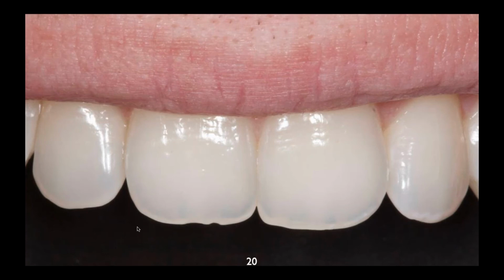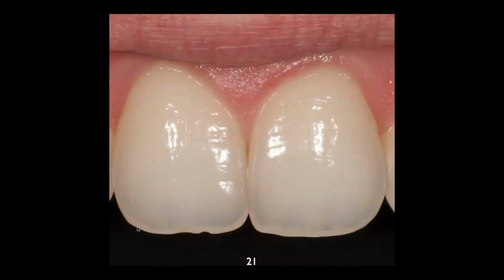The big problem I see with a lot of these zirconia crowns and big zirconia cases that have to have a natural color is that the framework, the zirconia that you put the porcelain on top of, is way too high. And there's no way that light can get through that the same way that a natural tooth does.